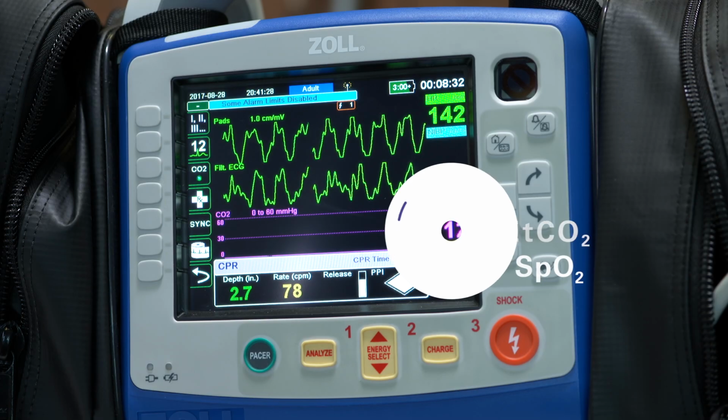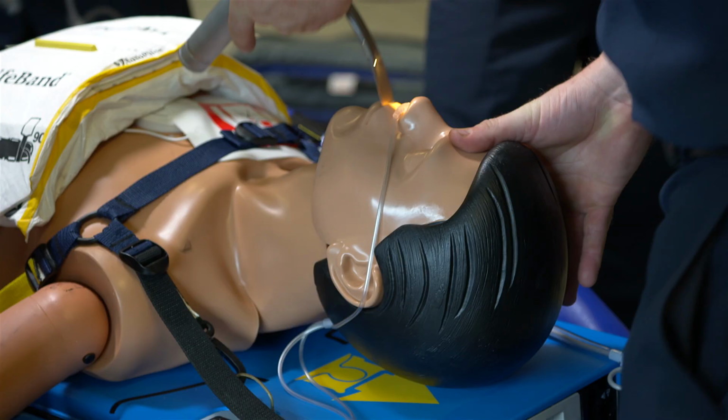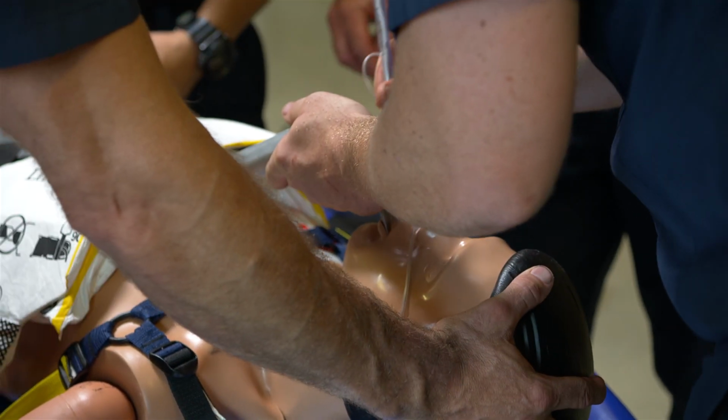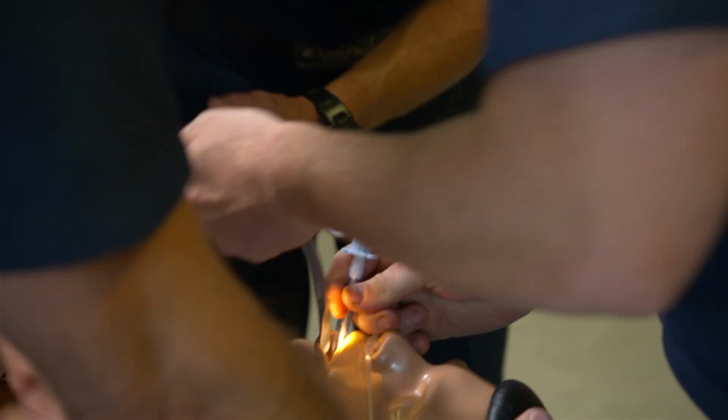We keep an eye on their saturation, and we keep an eye on their end-tidal CO2, and they're getting plenty of oxygen, and they're blowing off enough CO2 that they can take as long as they want to intubate, as long as those numbers stay good. Once we get the tube in the proper spot, the rescue pod goes on, and then the end-tidal CO2 sensor. We do it in that way on purpose to keep some of the debris out of the end-tidal CO2 sensor.